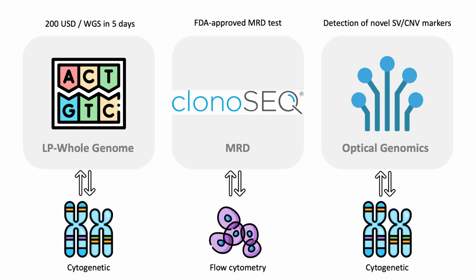So with that, I hope that I managed to show flavors of new technologies that are finding their way to the clinics, especially low-pass whole genome in cytogenetics. The summary here is the cost has dropped amazingly, and the turnaround time is reaching 5 days. clonoSEQ and similar methods could actually aid flow cytometry for MRD. And finally, if you are working in cytogenetics, I urge you to consider optical genomics as one of the tools to be done in the lab, to replace some of the tedious FISH and other tests. Thank you so much.